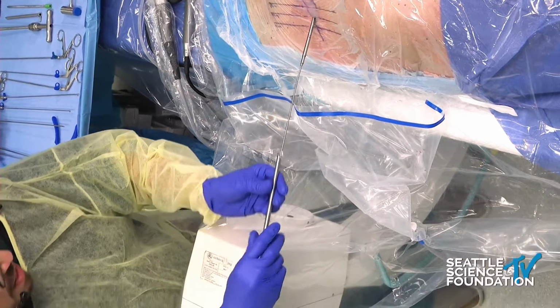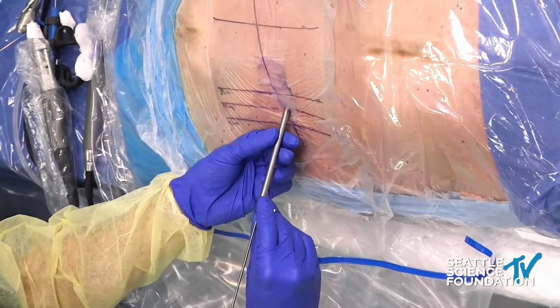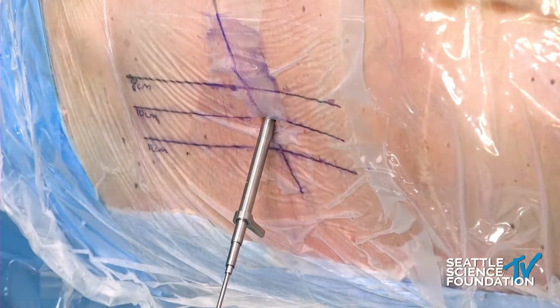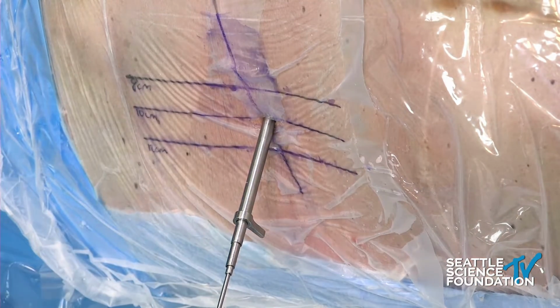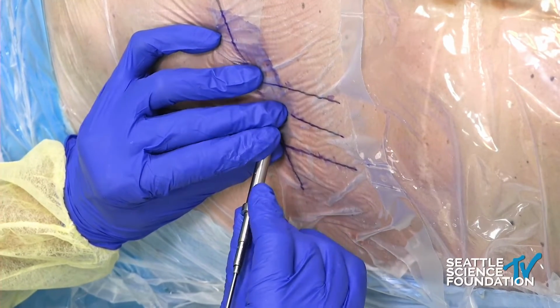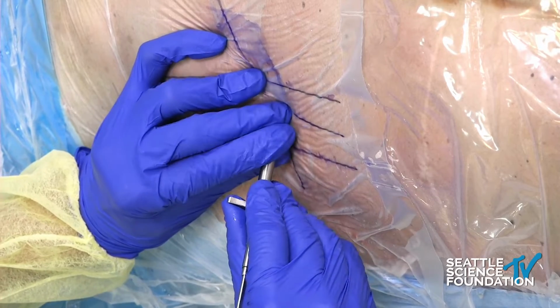So again, I'm going to go in where it's open towards the exiting route. Once I feel like I'm on bone, I twist it down. Especially if you're going for a medial disc, I push it in a little bit more. I slide on the PLL, and then you look up onto the pedicle SAP junction. So this is exactly where you want to be.